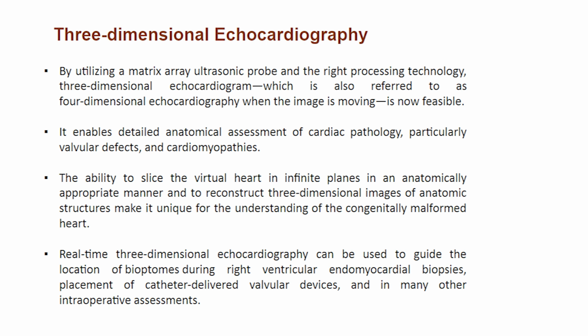The ability to slice the virtual heart in infinite planes in an anatomically appropriate manner and to reconstruct three-dimensional images of anatomic structures makes it unique for the understanding of the congenitally malformed heart. Real-time three-dimensional echocardiography can be used to guide the location of bioptomes during right ventricular endomyocardial biopsies, placement of catheter-delivered valvular devices, and in many other intraoperative assessments.